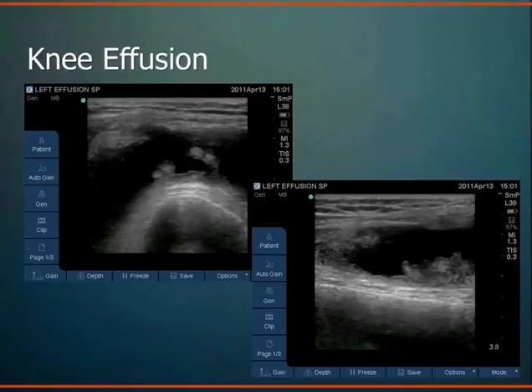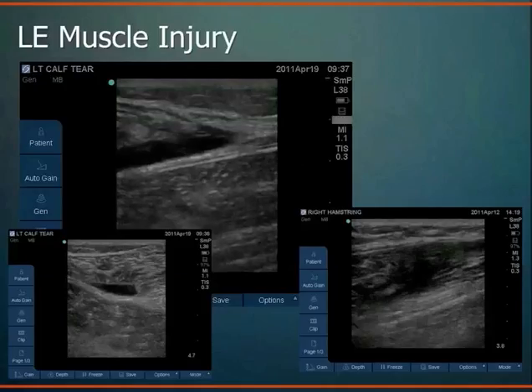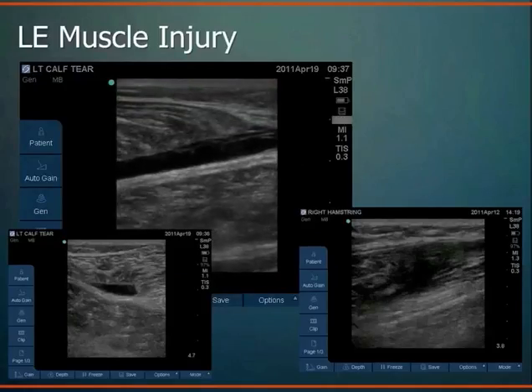Is this infection? Is this gout? Is this just arthritis? Is this acute hematoma? A lot of different things can cause a joint effusion. So if you need to aspirate that fluid, it's very easily identified: okay, that's where the suprapatellar pouch is. There's the swelling. Stick the needle right there, and you're right on it. So very easily visualized and very applicable to a clinical setting.